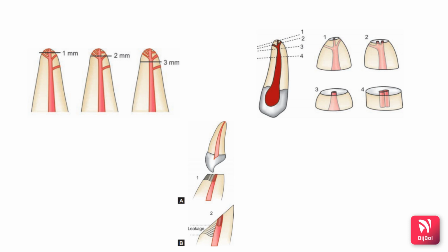And if you see the angle of the root end resection, earlier it was thought that the root end resection at 30 to 45 degrees from the long axis of the root facing the buccal or facially provides an improved accessibility and visibility of the resected root end.